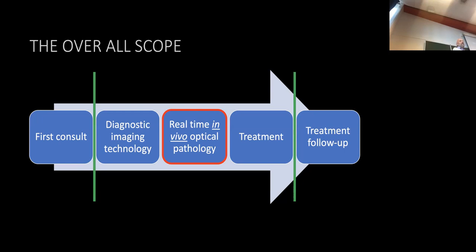It needs to be processed, it needs to be stained, it needs to be dried, it needs to be put on a glass, then the pathologist needs to take a look at it. That's a time consuming process. And optical technologies actually can really play a role there.